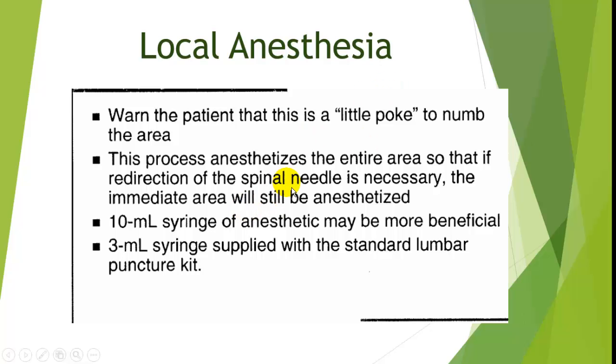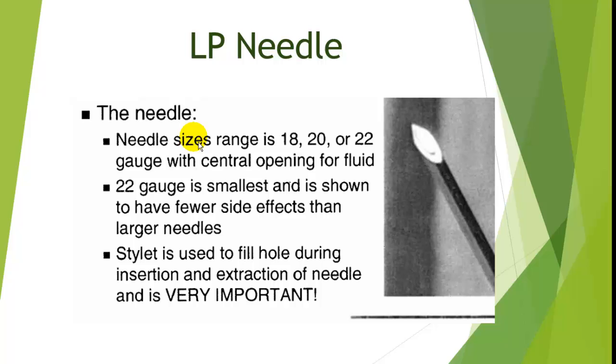Now, before you give the little local anesthetic, you have to tell the patient with the euphemistic little poke warning, or you could actually be honest and say it's going to hurt like hell. We'll leave that up to you.